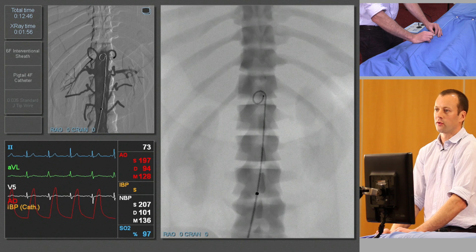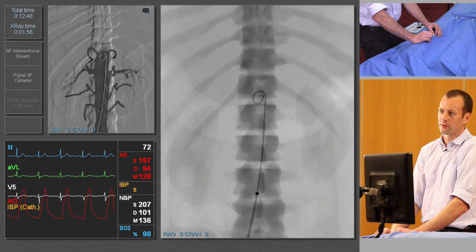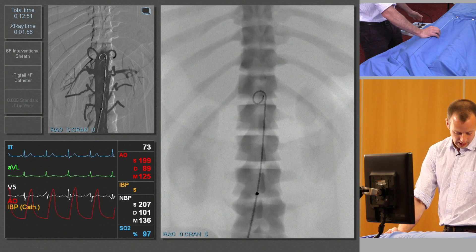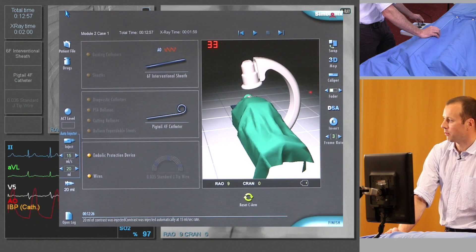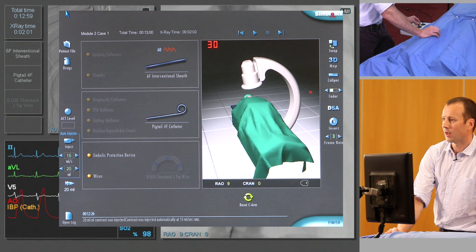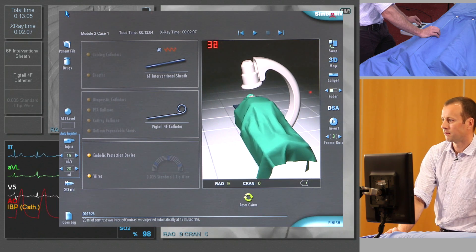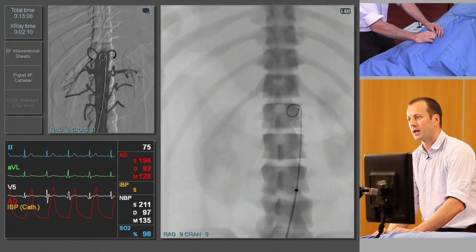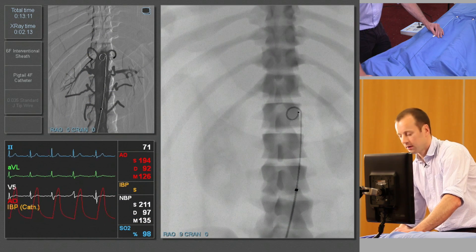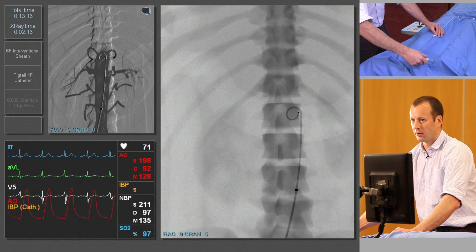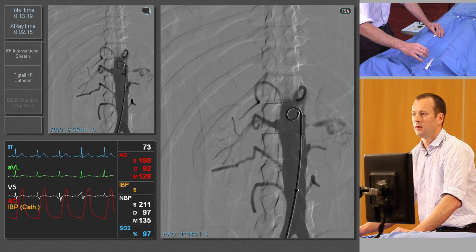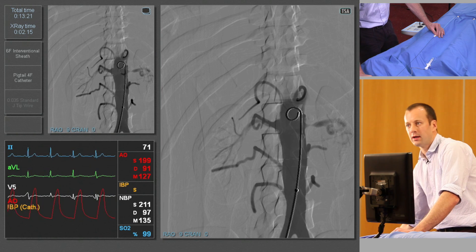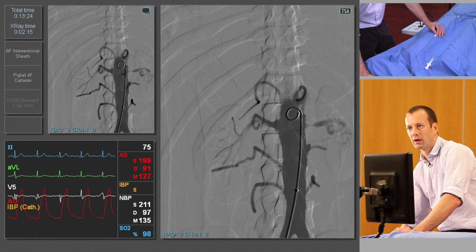On the left hand reference screen you can see the renal artery. On that particular image we've got some lumbar arteries overlying the renal artery, so it might be worth just adjusting the angle to see whether we can throw those off. We'll come into a little bit of a right anterior oblique and centre back over the right kidney, then bring the catheter back down a little. This time we'll try doing a hand injection. We've got a lumbar artery interfering with the picture but with a better view of the renal artery ostium.